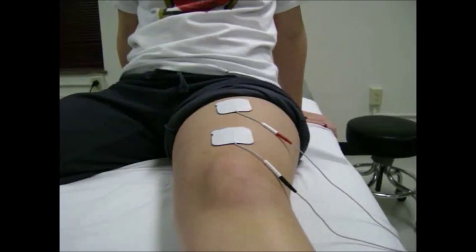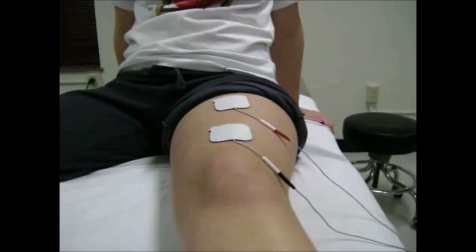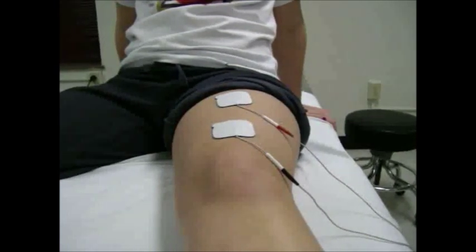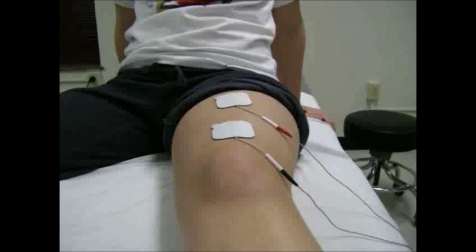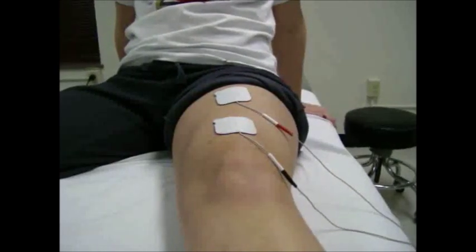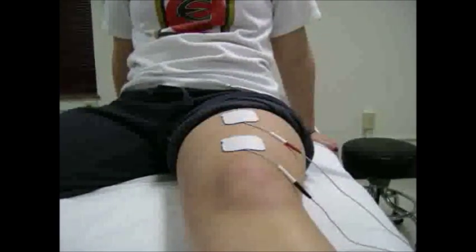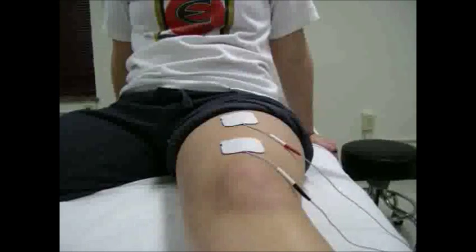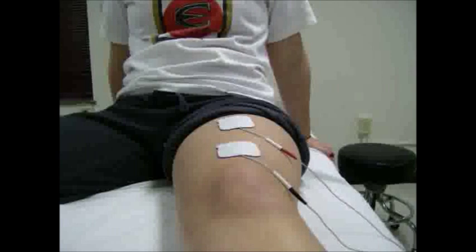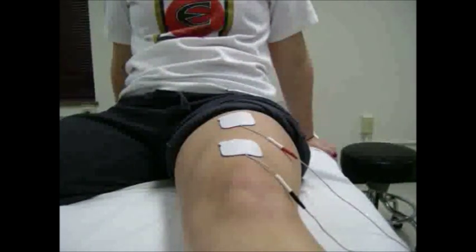Now at the current tolerable level, she is going to be doing quad contractions. We are now doing 3 sets of 10 repetitions each with the maximum amount of current tolerable. We have increased the current and she is going to contract her quad.